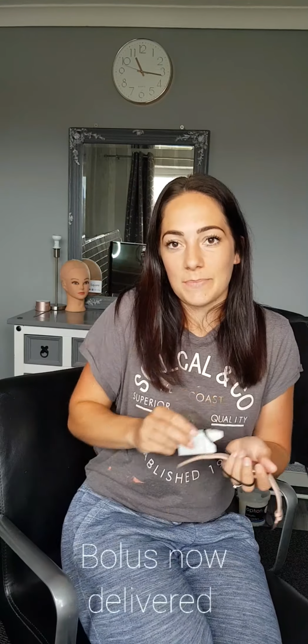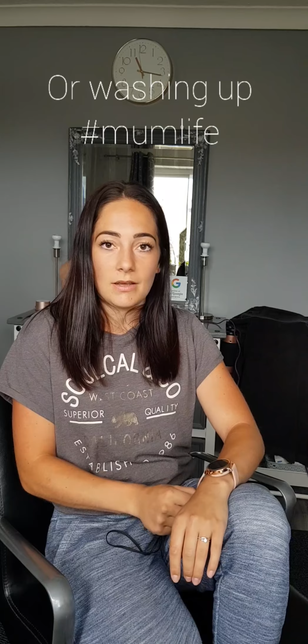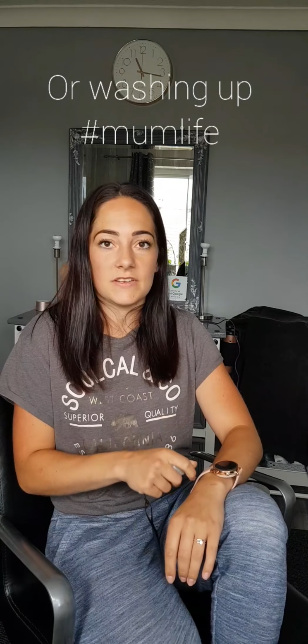That's the only one thing I have found, is that the Riley does need to be fairly close to you. So I can give myself the insulin, put the Riley next to it, and it will do it. If I've got it in my pocket and I'm working, I can just give myself insulin and think, I'm going to eat in 10 minutes, I'll give myself insulin now, and it does it for me.